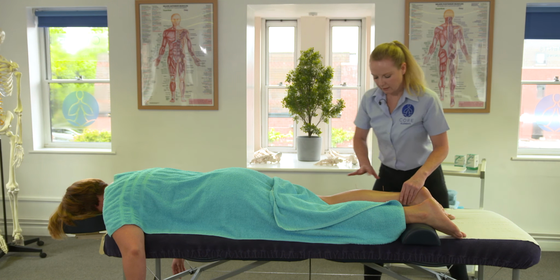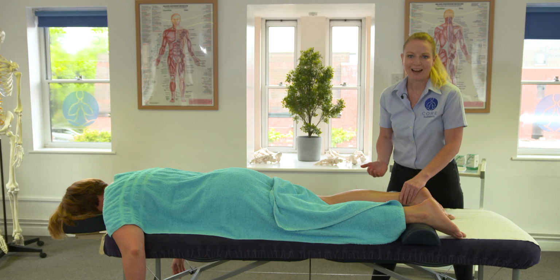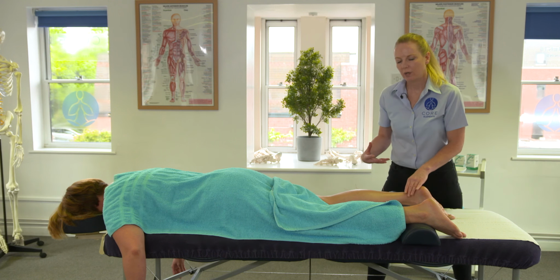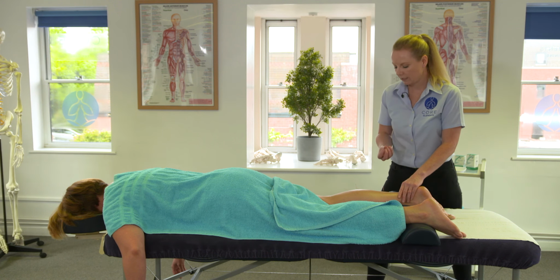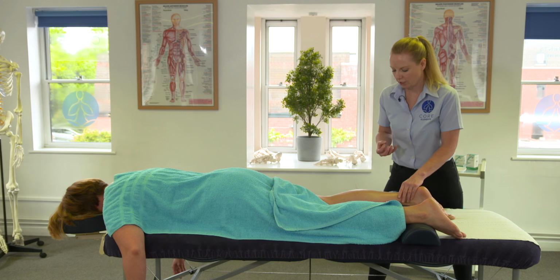So all of the needles are in nice and securely. I'm looking at the tissue here. Quite often we might see erythema coming off the needles, and that's going to tell us that we've increased the localized blood flow to the area of the tissue. And that's great for the healing process, because we know that when we increase that localized blood flow, that brings nutrients and oxygen into the tissue.